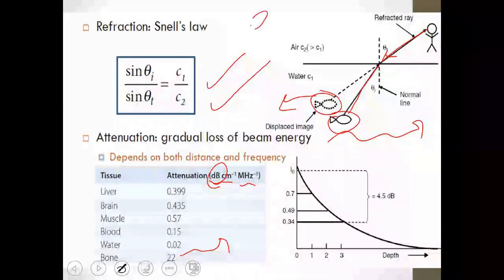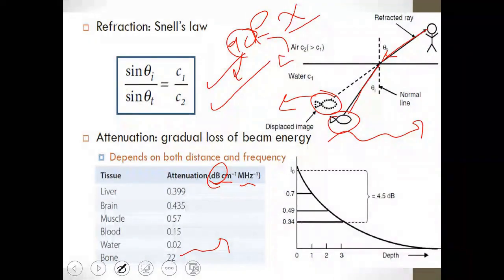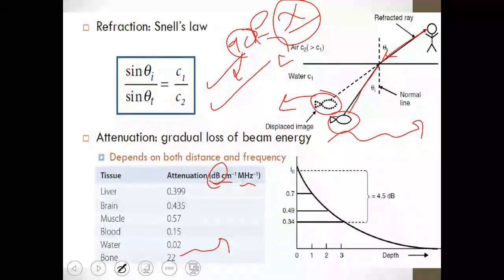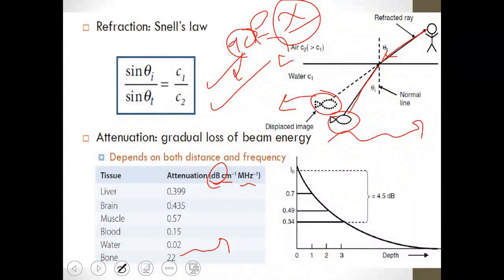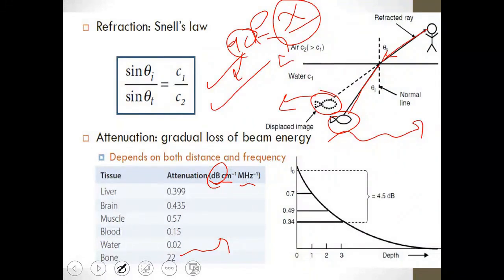As we mentioned before, attenuation depends on frequency, depth, and the attenuation coefficient. The attenuation coefficient is related to the tissues or materials, and the frequency is related to the ultrasound pulse. The higher the frequency of the ultrasound pulse, the higher the probability of interactions with the tissues and cells present, leading to a higher loss in its energy or intensity. This increases the amount of attenuation as you move a greater distance or to a higher depth in the patient. The rate of attenuation increases and the loss in the intensity of the ultrasound pulse increases.